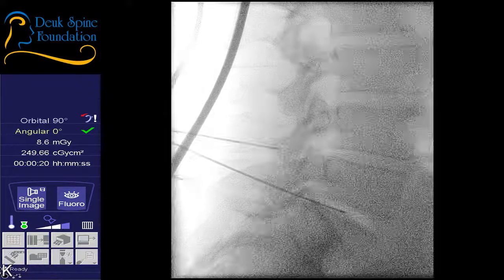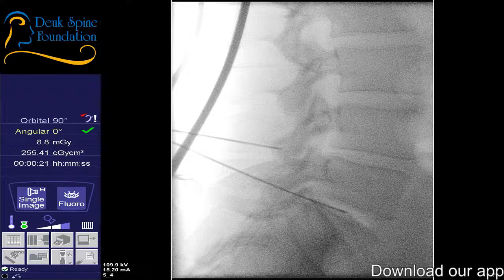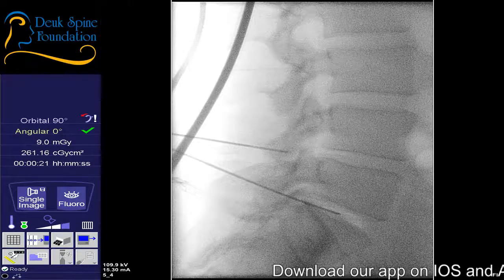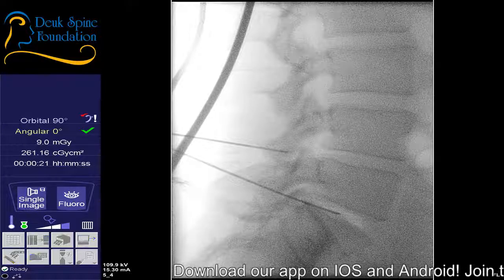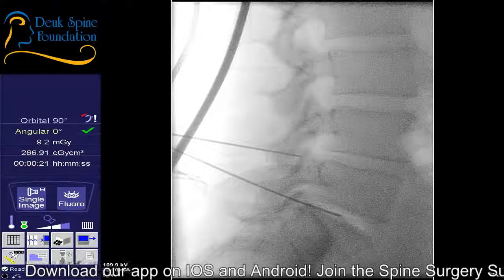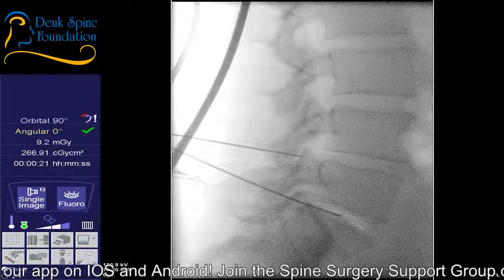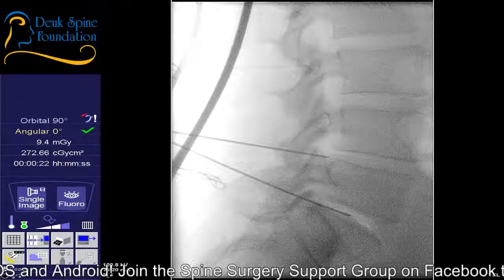This is an actual surgery. We're using a knife, we're making an incision, shot. We're using surgical tools. You can't use surgical tools through a needle. It doesn't work, shot. You actually have to do surgery, which is why it's a surgeon doing the surgery, not a pain management doctor, shot. Pain management doctors generally do needle procedures.